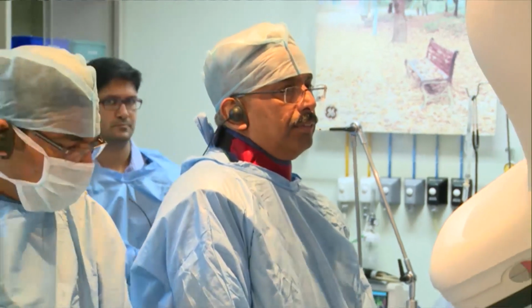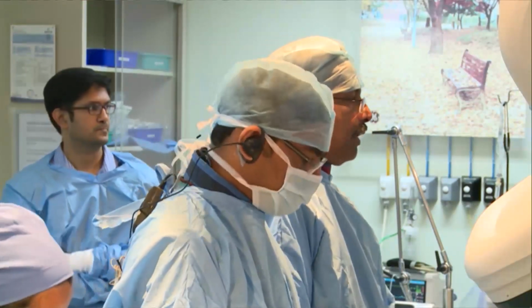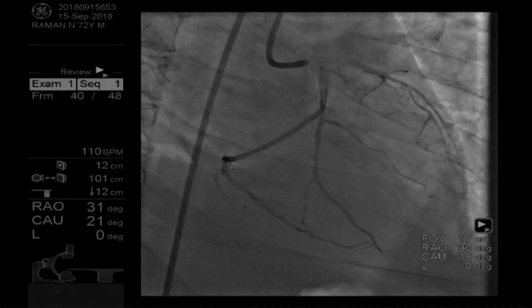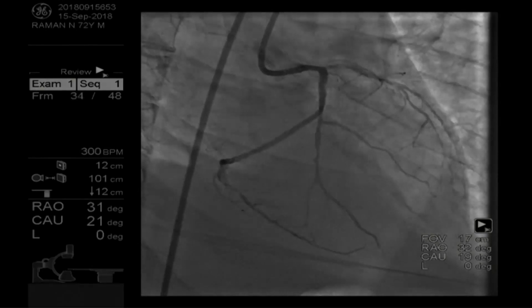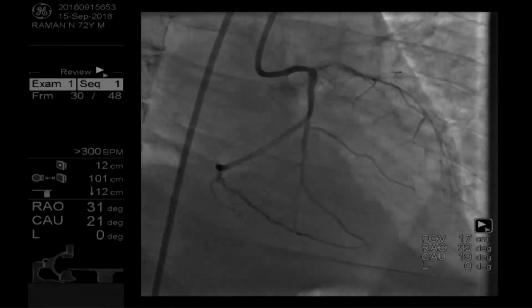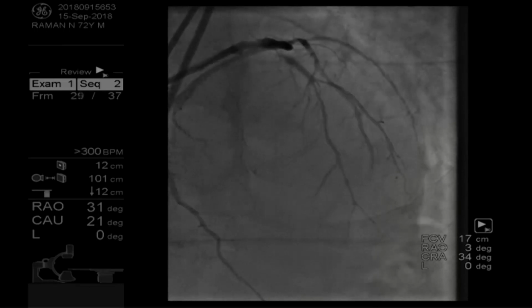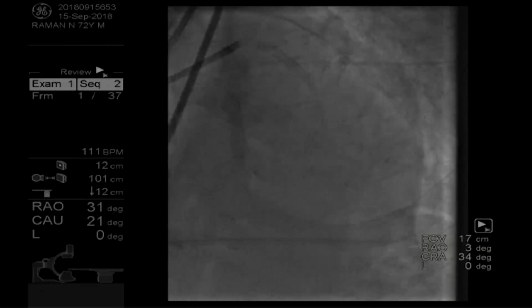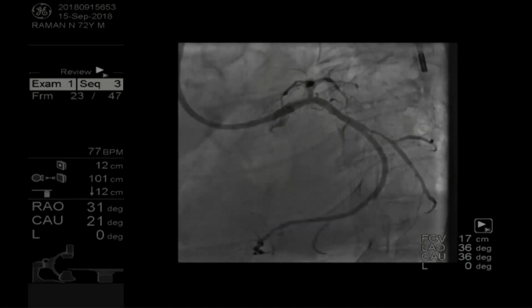How does the angio look today, sir? Okay, so let me just go through the angiogram of today. Can somebody play the angiogram of today? So as you can see, the LAD is the same. The circ looks okay. There are still some ratty lesions, but its flow is there. The TIMI flow is good. So I think that part of the story about the OM is okay, and you can see that the LAD is full of calcium, and you can see that there is disease in the LAD and it's a left dominant circulation.